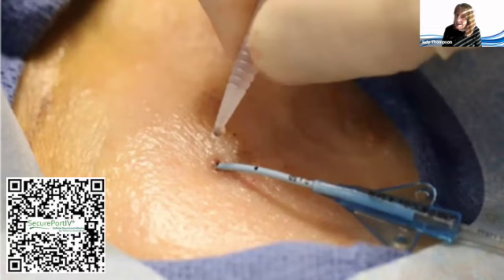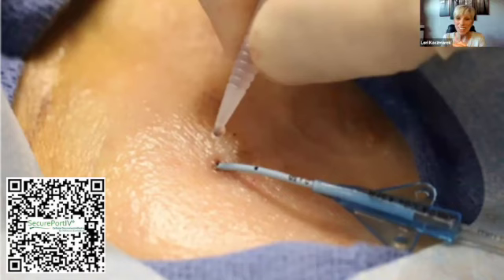Perfect. This is a question we get on a lot of the webinars with you. Does the tissue adhesive cause problems removing the catheter, sticking to the catheter, causing skin to tear upon removal? Great question, and happy to answer it. It's easy to remove. Whatever you do now to take your dressing off is the way you would take your dressing off with tissue adhesive on there.